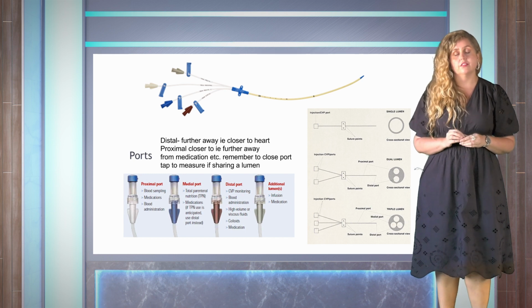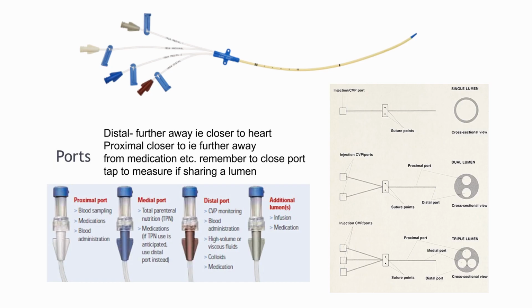Always use the distal. On the proximal side, the function that's reserved for proximal is blood sampling. So if you draw blood from the proximal, it's going to have the most original blood that's not mixed with TPN or inotropes or sedation or maintenance with glucose and potassium. It's the one that's furthest away from the heart, and because the blood is traveling in one direction into the heart, you shouldn't have a mix. That is the lumen we use for blood sampling, proximal.